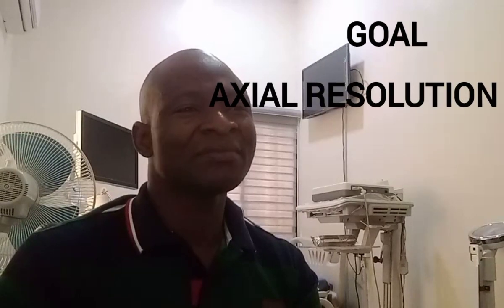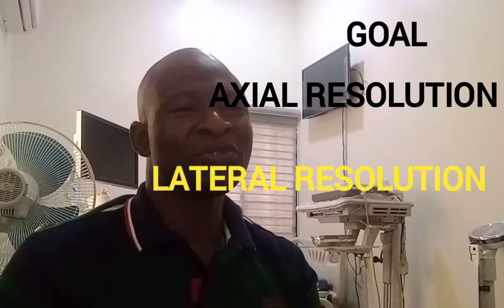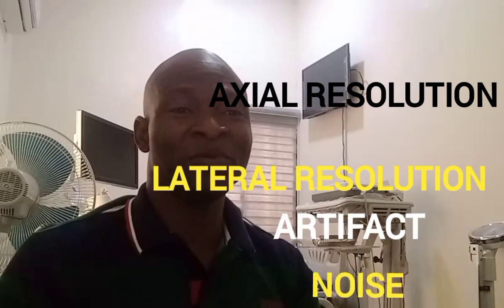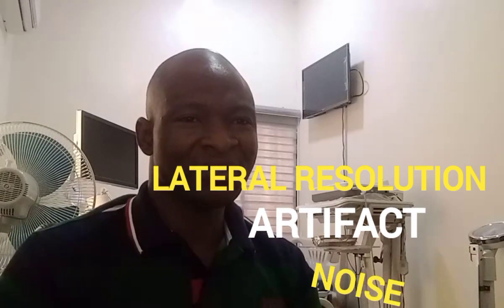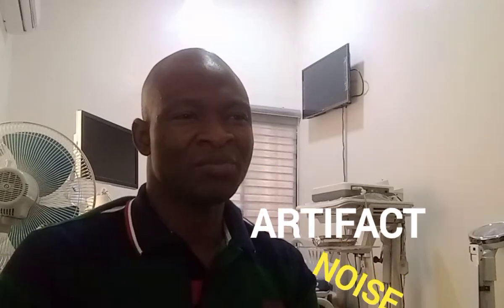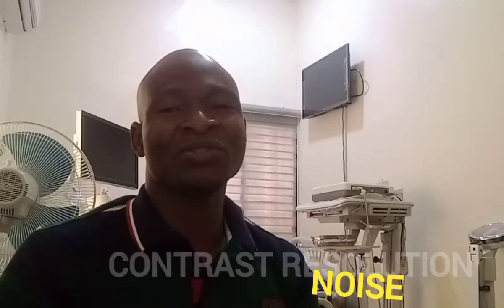So what is the goal? The goal is to improve axial resolution, to improve lateral resolution, to reduce image artifacts, reduce noise, especially in obese patients and others who are difficult to image with normal grayscale imaging. The goal also is to increase contrast resolution.